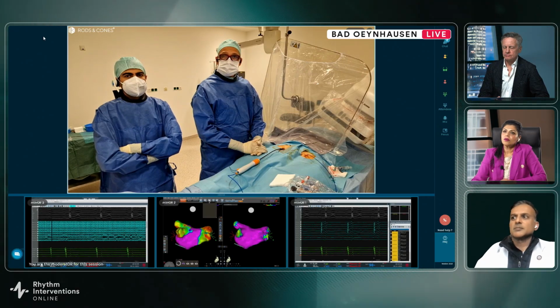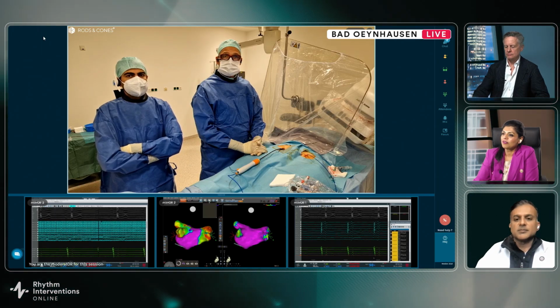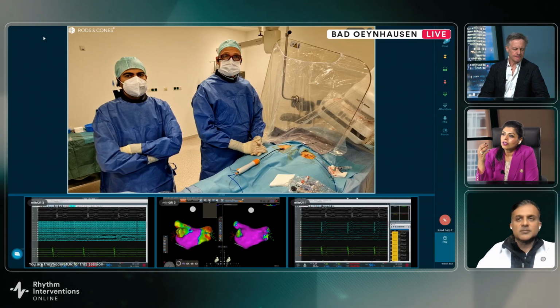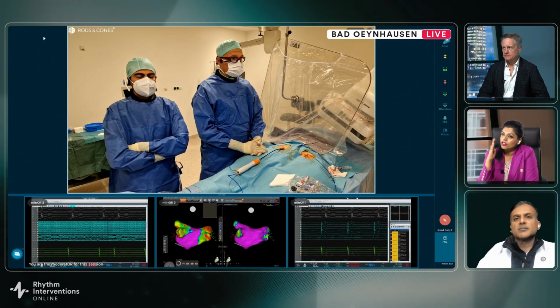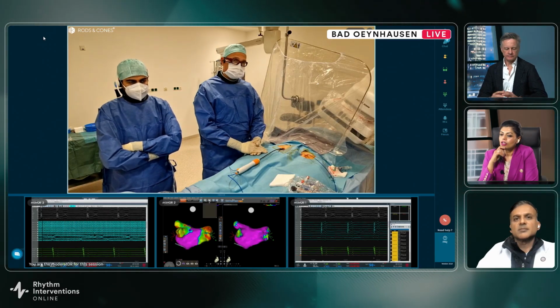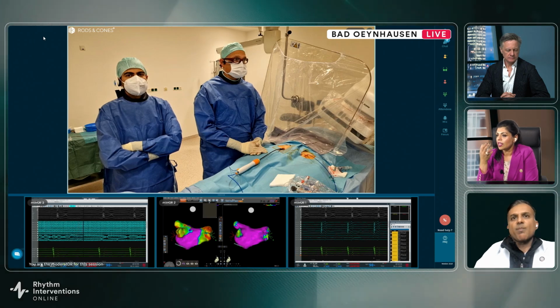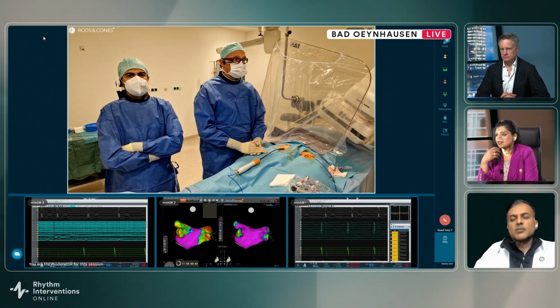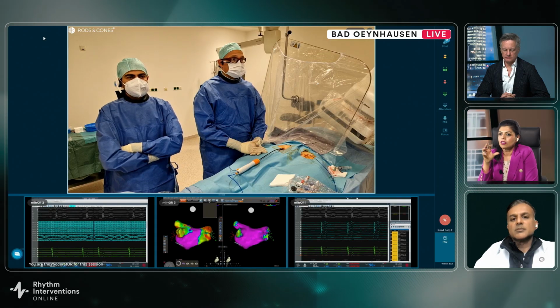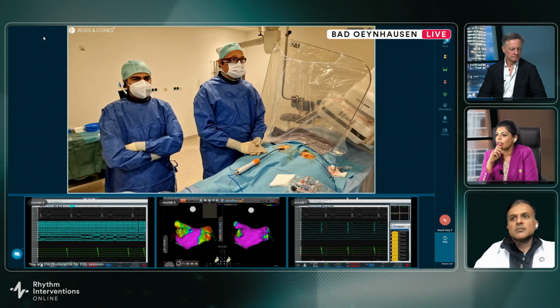I would say that I'm going to use every adjunctive tool I have to assess contact, because remember, this is a 3-dimensional catheter, and with 2D ICE you're just looking at one plane, right? So I don't have to keep rotating or moving the ICE too much to assess contact. I'm using ICE to maneuver the catheter easily, not use fluoroscopy. That is really the main purpose for me to use ICE, but I still use the TPI, absolutely, to assess contact.